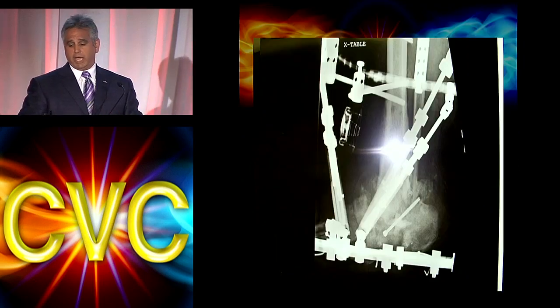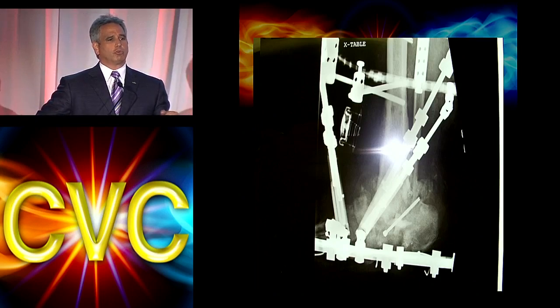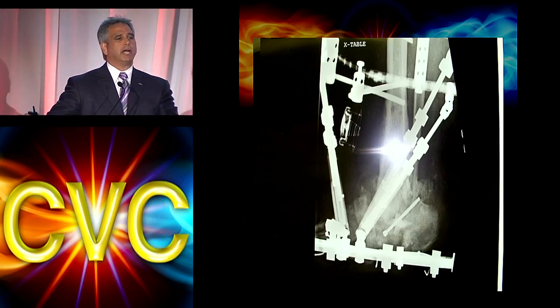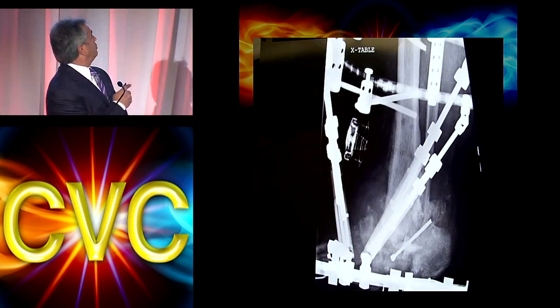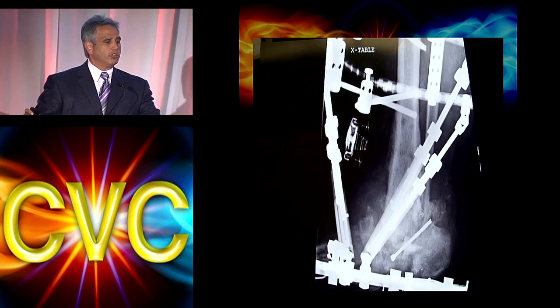So again, put him back into an external fixator now. What I did is I put one screw through him, and that was to hold the cuboid and the calcaneus and that tuber that I have just put in. But watch what his body did to this. Now, the calcaneus, if you don't know, is the most vascular bone in the body, and this is him following up. And if you watch very simply here, you can see that this area is going to disappear, and you can just watch it happen.